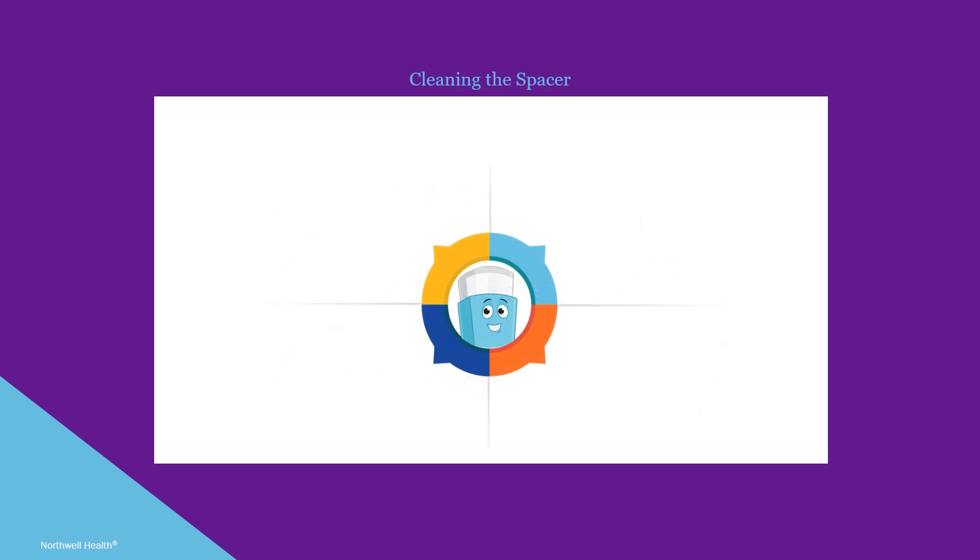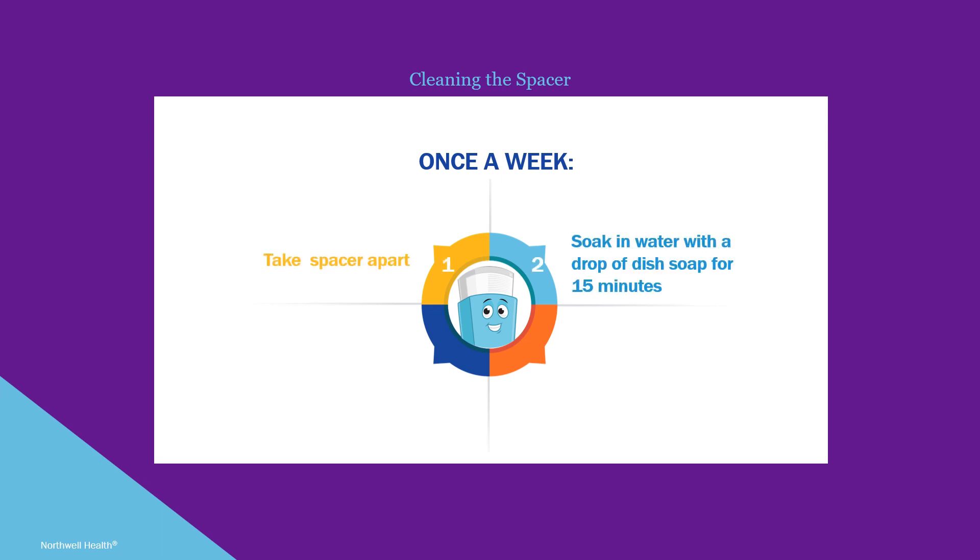Now let's look at how to clean the spacer and inhaler. Cleaning the spacer once a week will help make sure it performs properly. Take the spacer apart and soak it in a bowl of water with a small dime-sized drop of dish soap for 15 minutes. Rinse the pieces in warm running water and let them air dry on a clean towel or dish rack overnight.